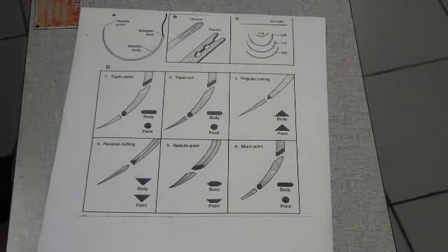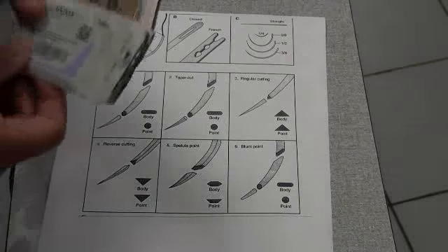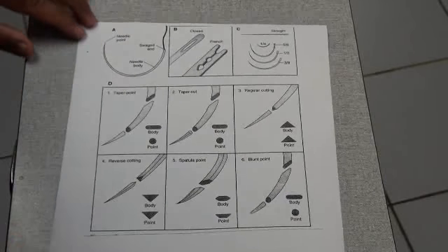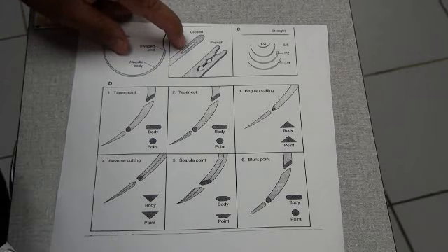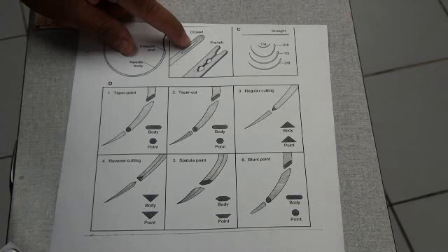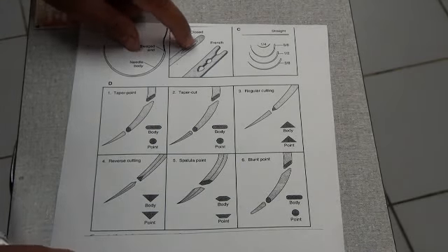Actually, before I go into that, these needles, there are 2 types of needles. There are the eye needles and the swaged needles. Eye needles look like your common threading needle. You would thread the suture material through that.